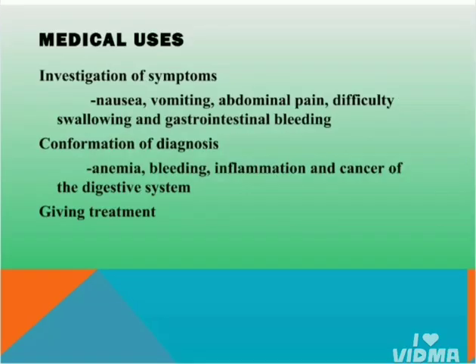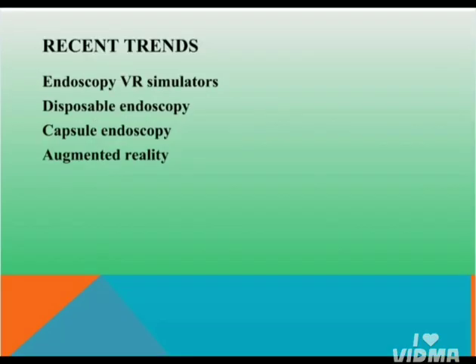Medical uses: for investigation of symptoms such as nausea, vomiting, abdominal pain, difficulty swallowing, and gastrointestinal bleeding; confirmation of diagnosis of anemia, bleeding, inflammation, and cancer of the digestive system; and for giving treatment.